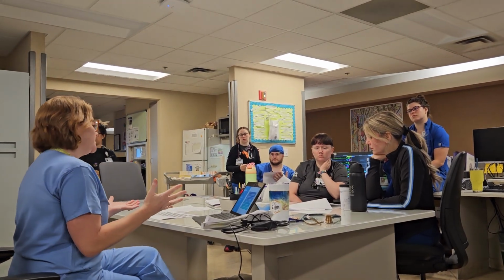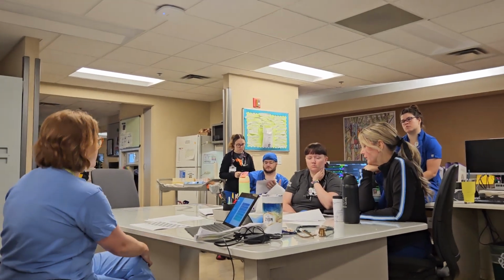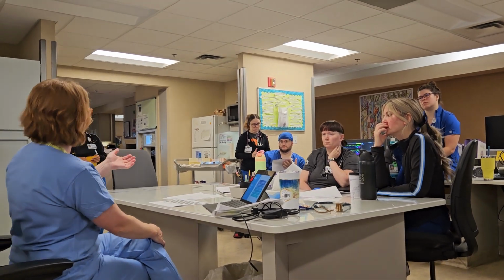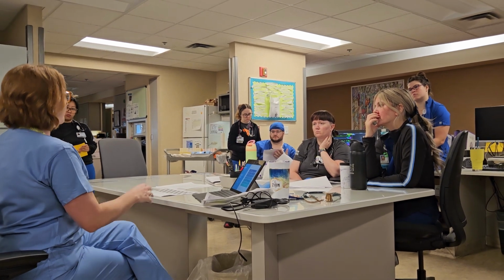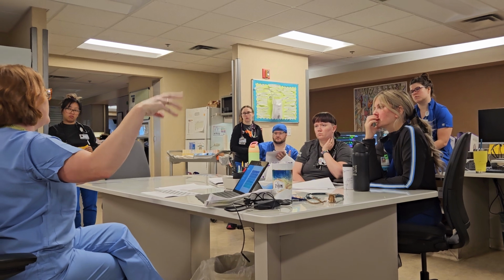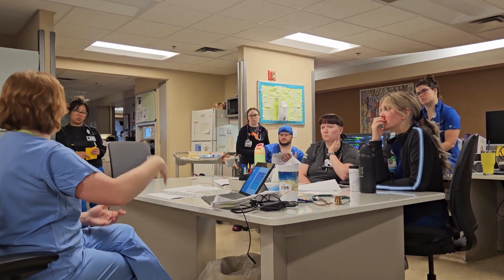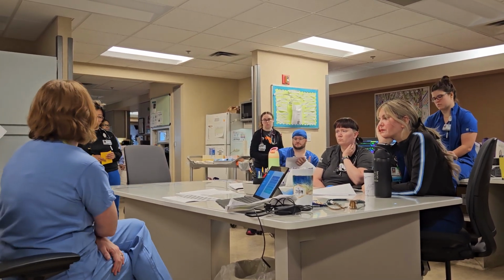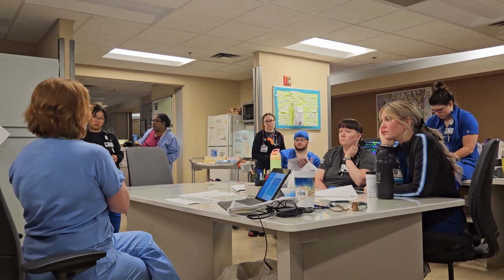So a great pressure support trial, which we use to assess weaning or readiness for extubation, typically starts at about 10/5. 10 is the inspiratory pressure support that we're providing only if a patient initiates a breath on their own. Our ventilators are really smart, so they have built-in safety tools to make sure that people don't go apneic and we just let them stay apneic, right? It kicks in at 30 seconds, or whatever time the vent is set to, if somebody's apneic on pressure support. It's not targeting a tidal volume at all.